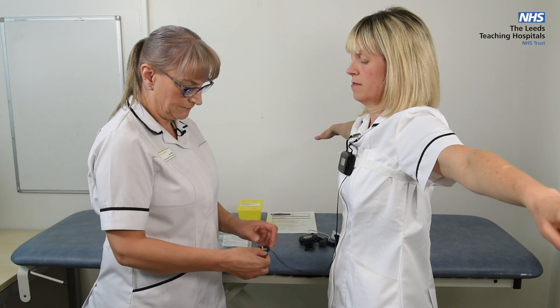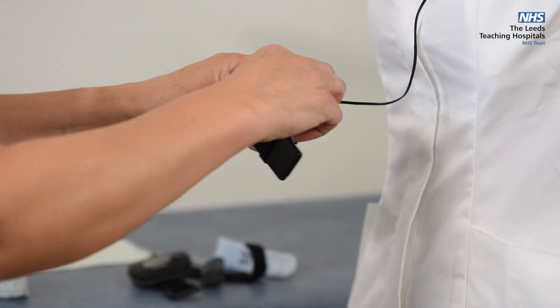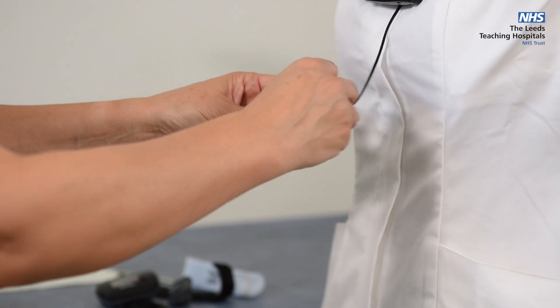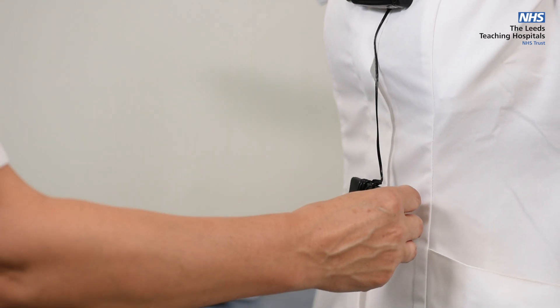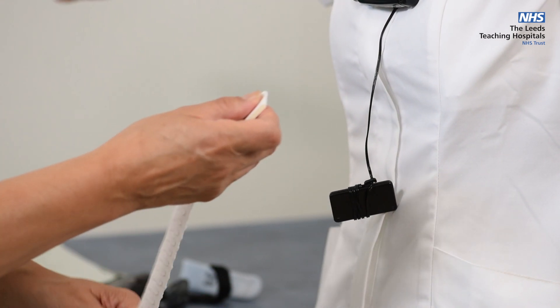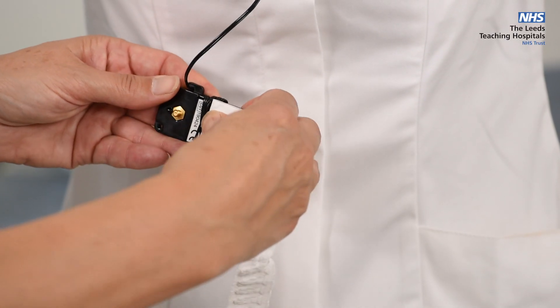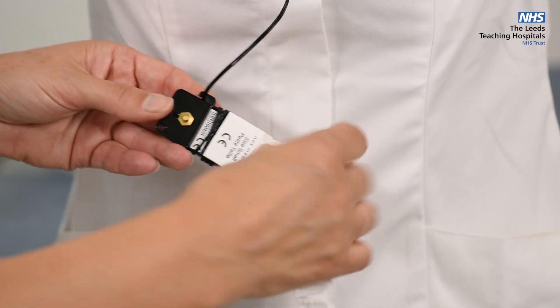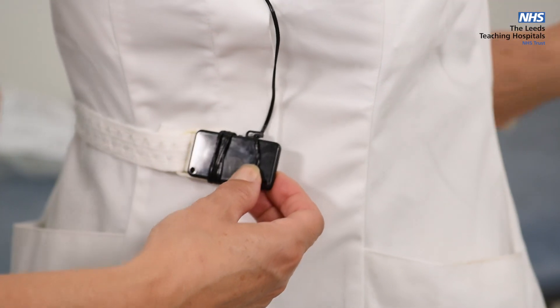For the second portion, wind the wire around until it reaches belly button level and secure it under the little clip. Take the second band and attach to the press stud on the back again, feeding the band around the waist and connecting on the other side.